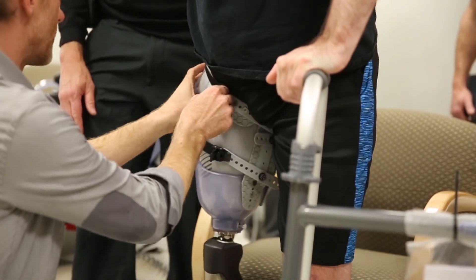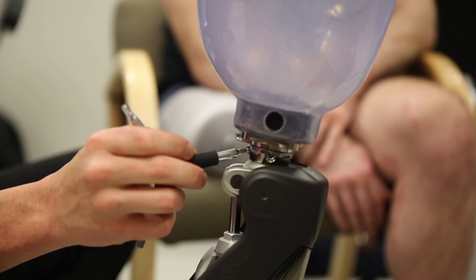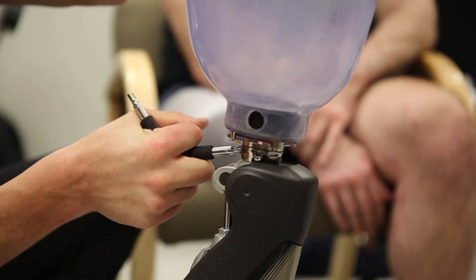My goal is to make comfortable sockets accessible to all amputees, and that's what I love getting to do. Through creating this technology — a more comfortable socket design — as well as getting to work with amputees, hear their stories, and see the impact that this technology is having is my favorite part.